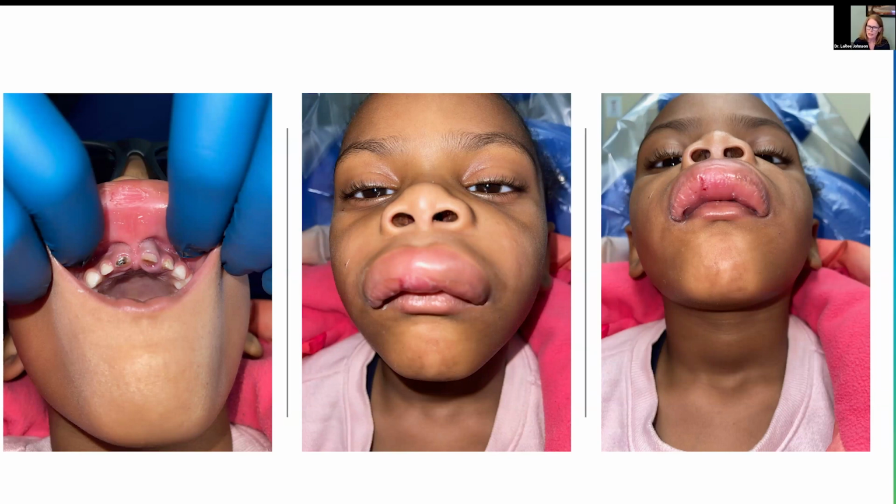So in this situation, I want to talk about thinking out of the box. If you look at that level of infection and that diffusion of a highly acidic, pressurized environment, the approach you want to take is probably not to go from the facial. In this situation, I would say very compassionately, I would likely plan to blanch right at the papilla as usual, and then maybe let it be a little bigger blanching so it can sneak through that diastema. And I would actually approach through the palatal, through the blanched area.